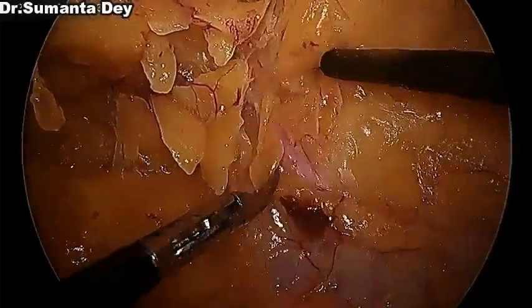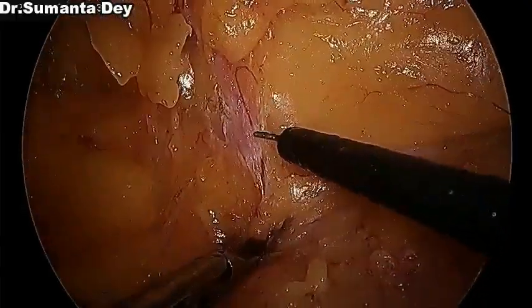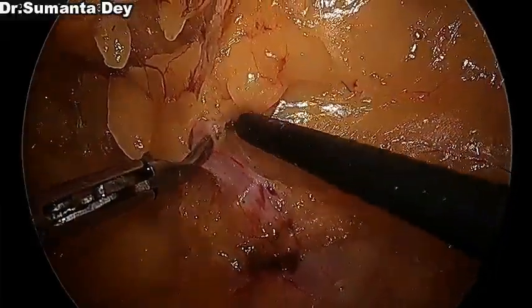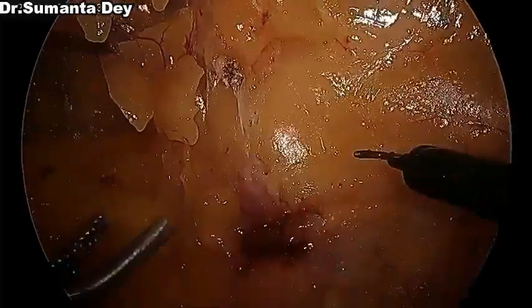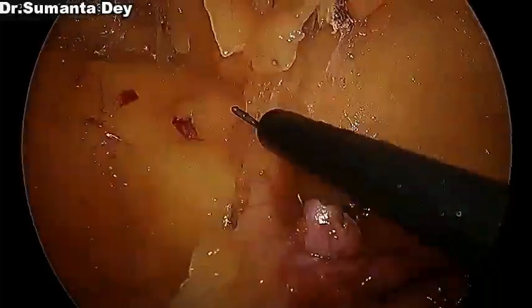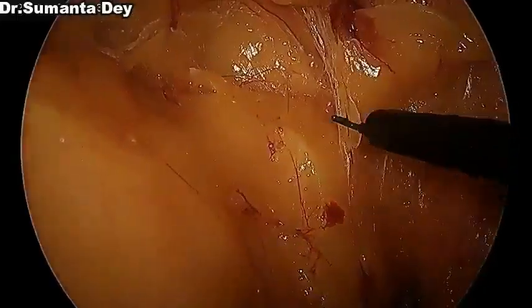So here over the right groin I will encounter the round ligament, the right side round ligament. So here you can see the peritoneal deflection. And now I'm identifying the round ligament and dividing it close to the peritoneal reflection, so that there is less chance of injuring the genital branch of the genitofemoral nerve. And once you have divided the round ligament, the peritoneum mobilization becomes much easier.